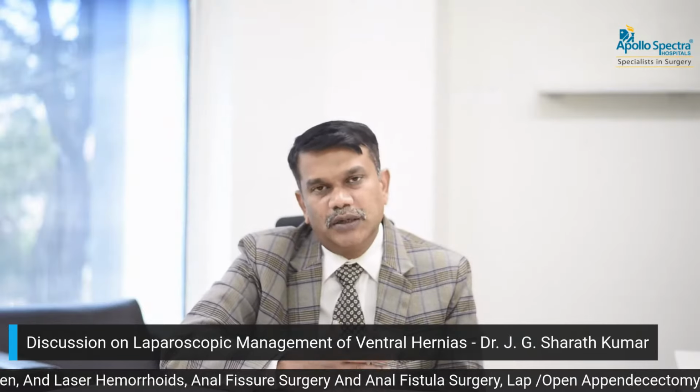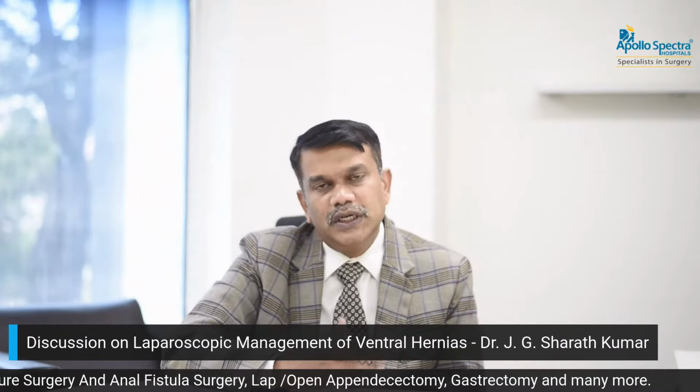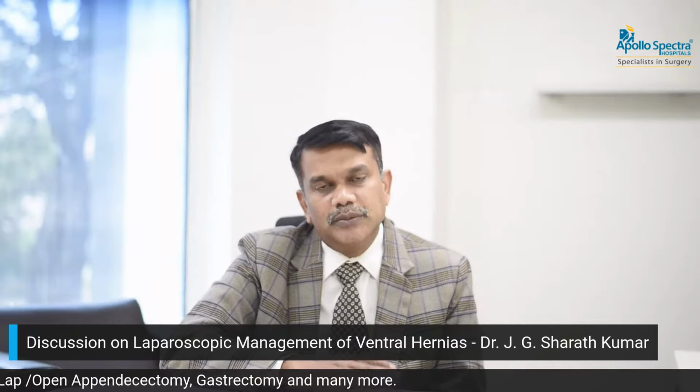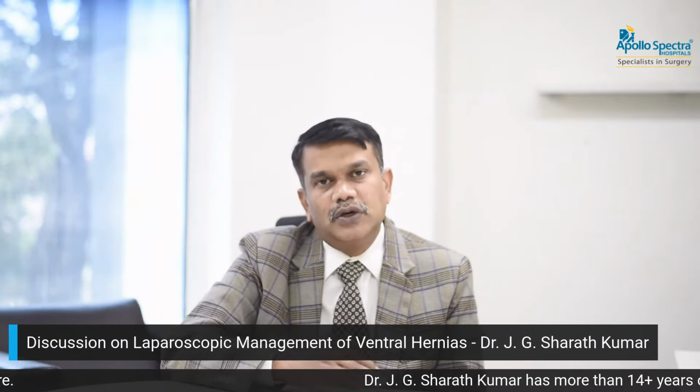In any hernia repair, you have to place a mesh, it's called hernioplasty, for strengthening the abdominal wall. So in this laparoscopic ventral hernia mesh repair, we'll use a dual mesh or a composite mesh. One layer is an absorbable layer, another is a non-absorbable layer made of polypropylene. The absorbable layer is facing toward the intestine, and the non-absorbable facing the abdominal wall. After putting the mesh inside the abdominal cavity, it is brought to the anterior abdominal wall. It is fixed using the transfascial sutures.